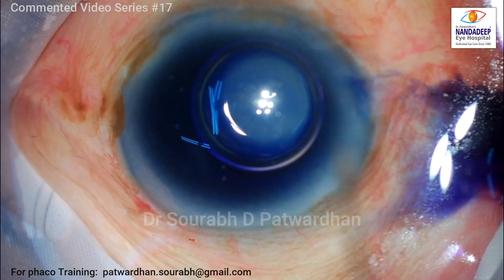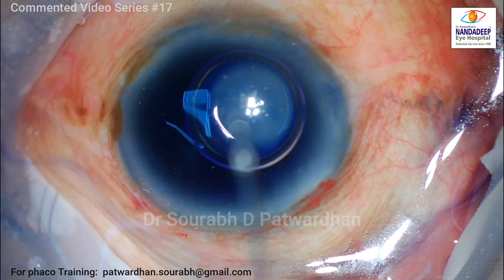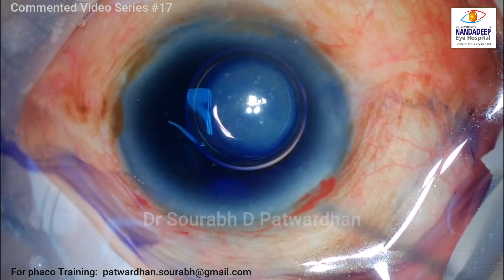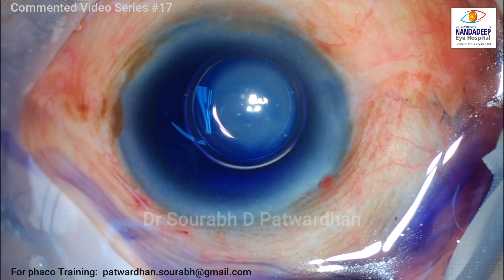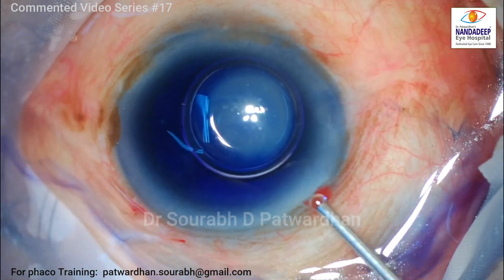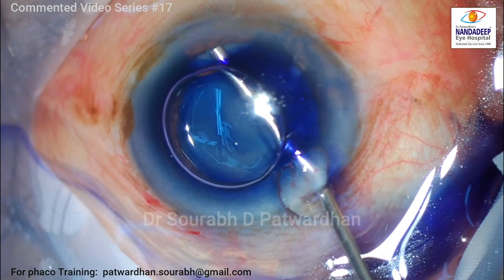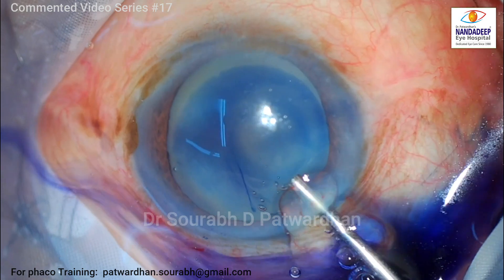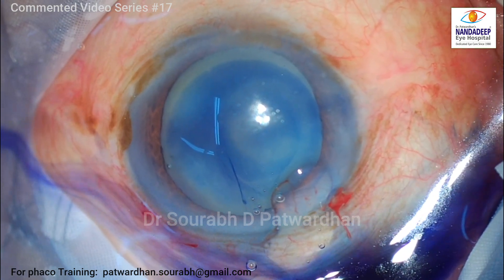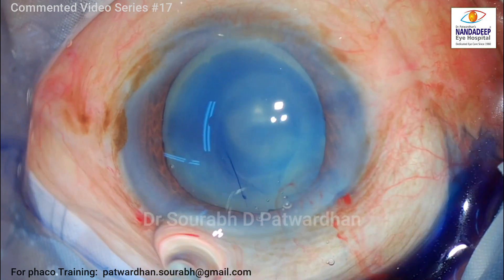This particular case was given a peribulbar block because the patient was a little bit apprehensive and uncooperative for topical, and also the patient had a complex cataract. I am also using a new machine which is new to me and I have to set the parameters. So I will be going slow and changing the parameters as I see the response of the machine.